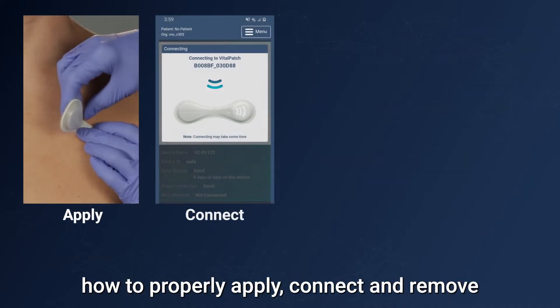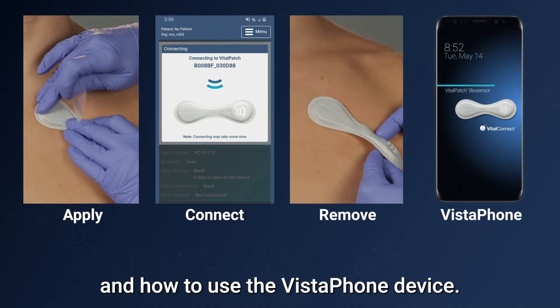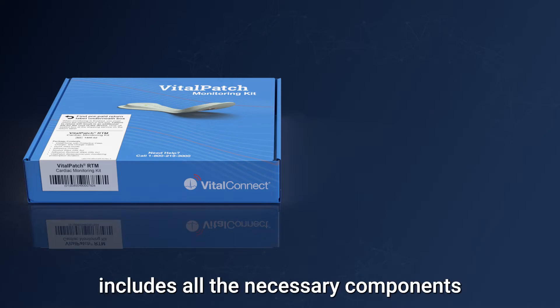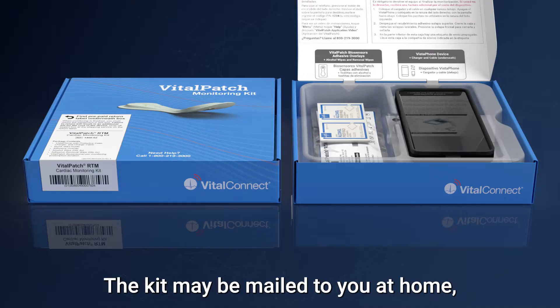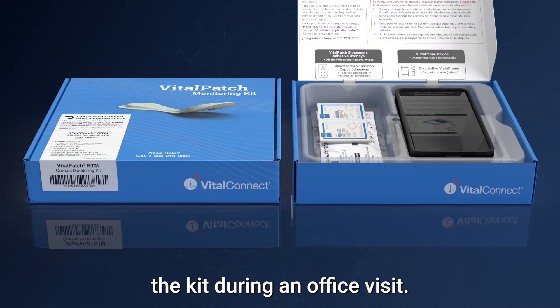This video will walk you through how to properly apply, connect, and remove the Vital Patch biosensor and how to use the Vistaphone device. The Vital Patch monitoring kit includes all the necessary components for cardiac monitoring. The kit may be mailed to you at home or your care provider may give you the kit during an office visit.